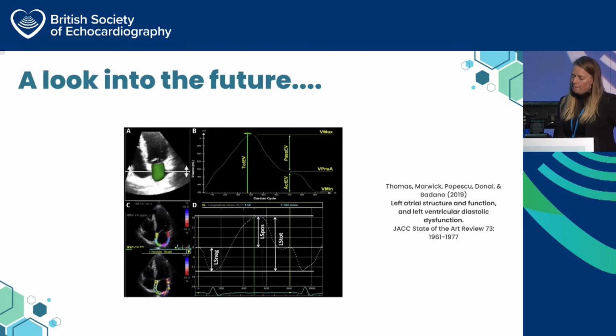And then the last slide, just a look into what the future might hold. I mentioned at the start about the atria having phasic function, and there's quite a lot of interest now in what those different phases of atrial function potentially tell us. I'm not going to talk about it because I'm not an expert on this at all.